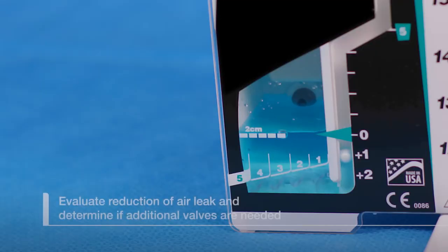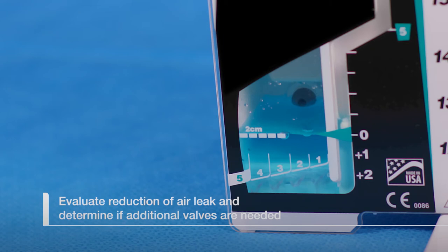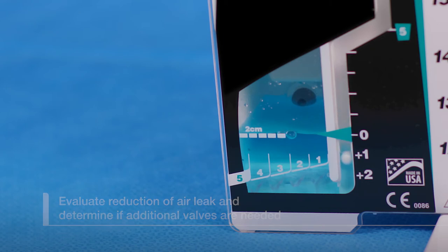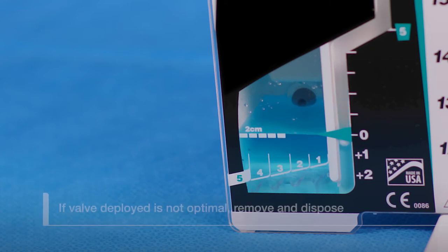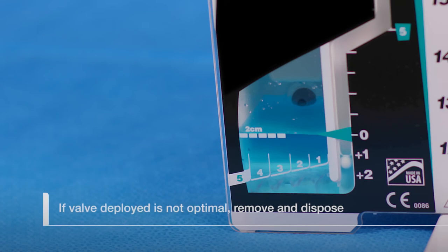Evaluate the reduction of the air leak and determine if additional valves should be deployed. If at any point the position of the deployed valve is not optimal or appropriate, remove and dispose of the valve.